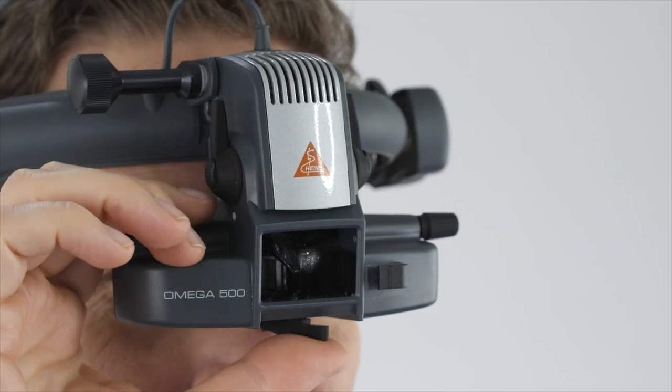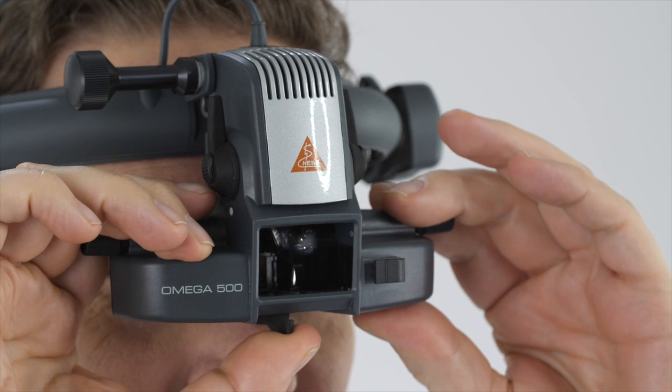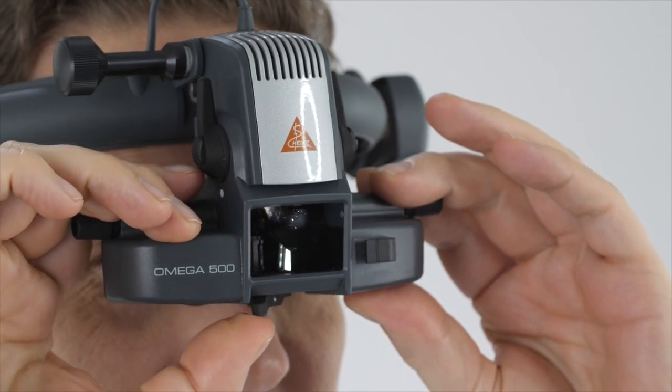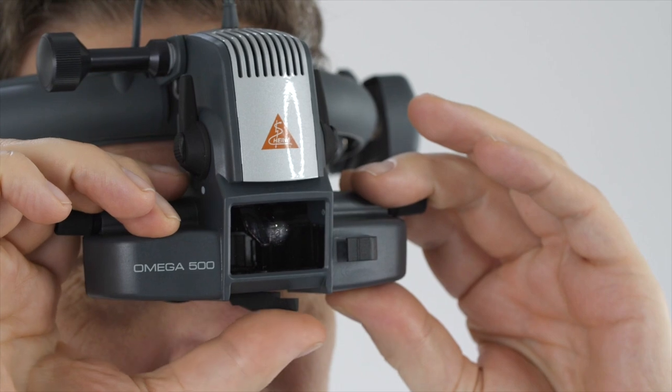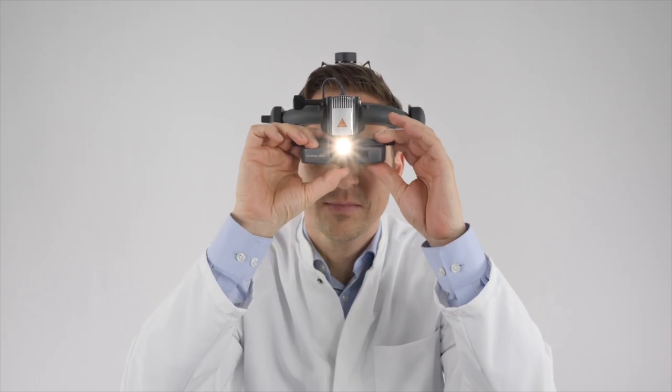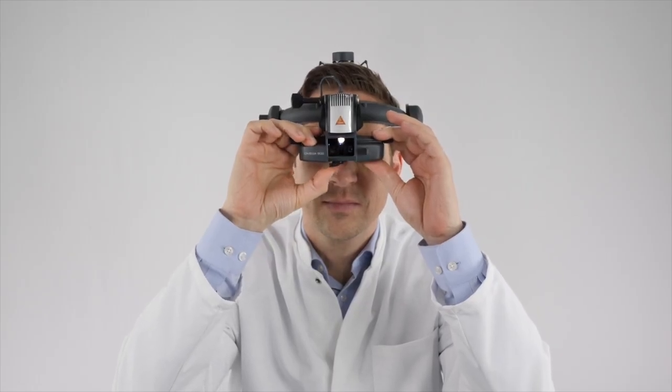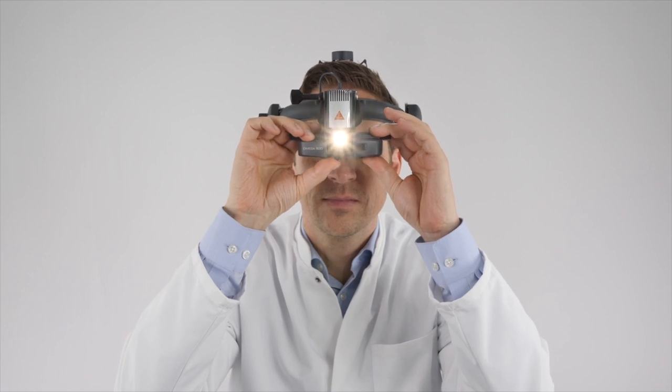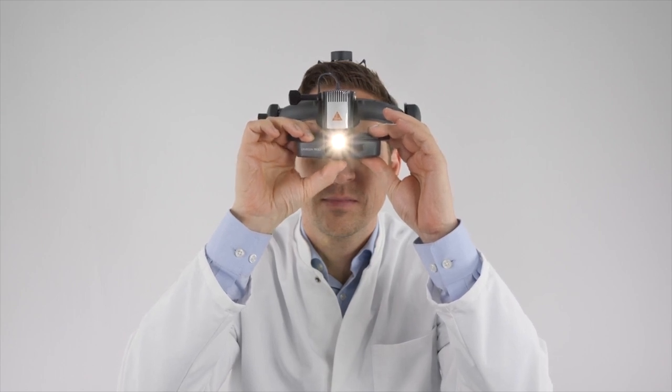And here's the best part. There is still a lever underneath the optics unit. It allows you, and this is unique, to adjust convergence and parallax synchronously. You can now easily adjust the optics of the instrument to enter a smaller pupil size without sacrificing stereopsis.